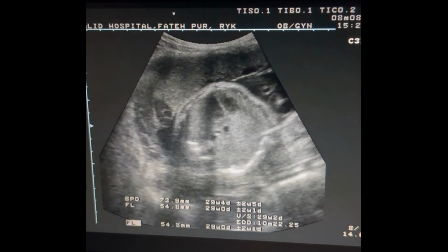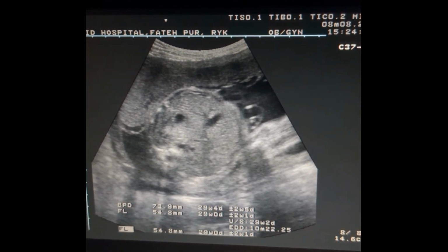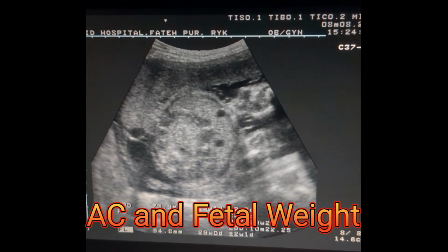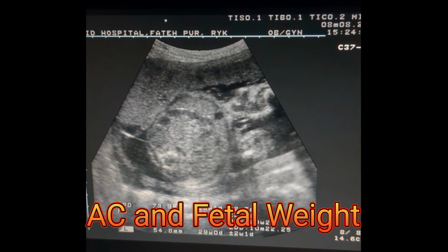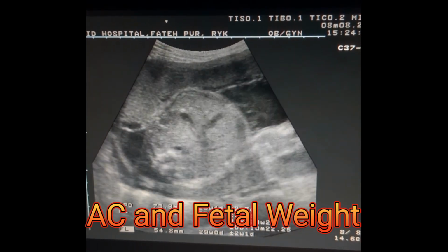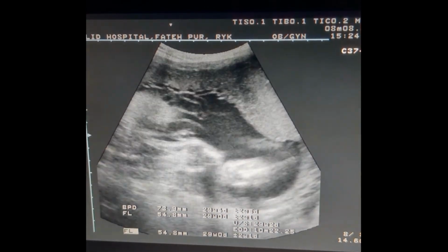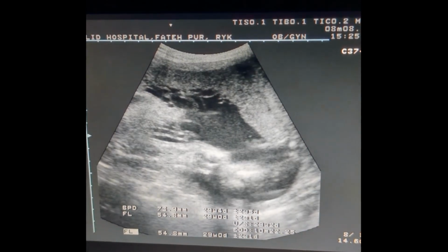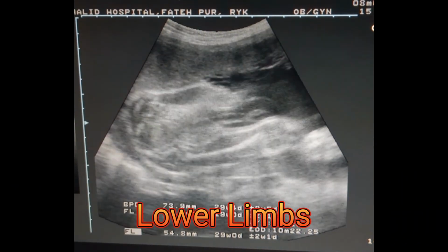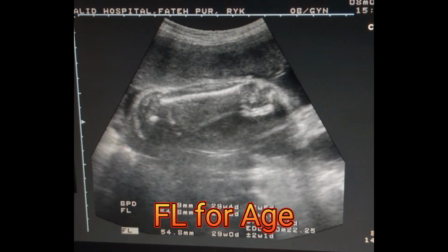Now we are going to measure abdominal circumference and also fetal weight. Here are the fetal lower limbs. Now we measure femur length for fetal age measurement.